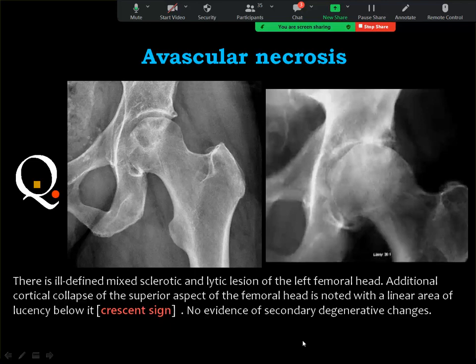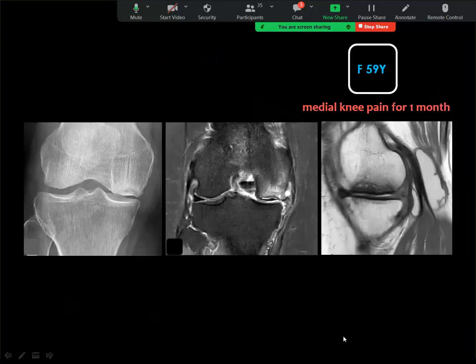And you don't have the right to say that this is on top of avascular necrosis or on top of so and so. You are dealing actually with a final diagnosis, which is osteoarthritis.